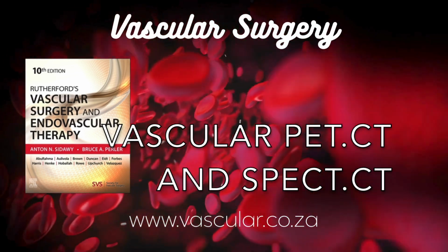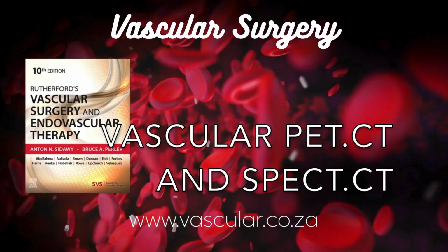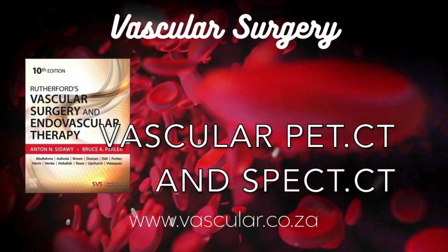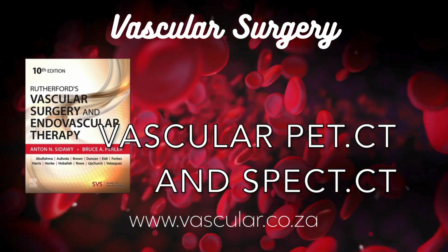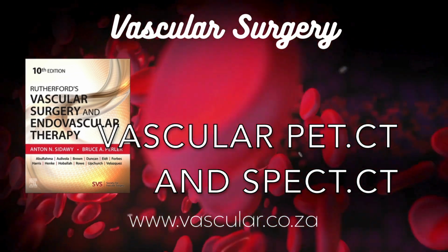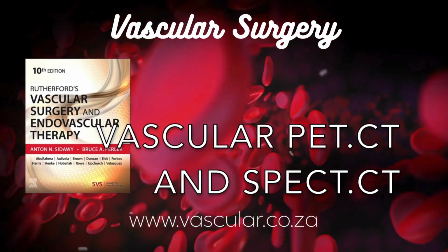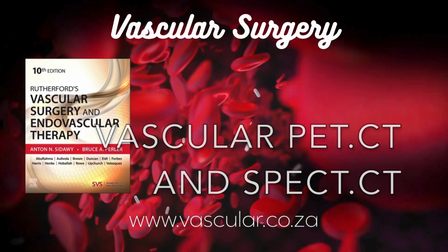Is there evidence linking this uptake to actual clinical events like stroke? Yes, definitely. A key early study by Rudd and colleagues looked at patients who'd had a TIA, a mini stroke, or a recent stroke caused by carotid artery disease. They found significantly higher FDG uptake in the carotid plaque on the side that caused the symptoms compared to the plaque on the other side. And importantly, when they examined the plaques surgically removed from these patients, the areas with the highest FDG uptake on the scan corresponded directly to areas packed with macrophages, those inflammatory cells. Wow, a direct correlation between the scan signal and the cellular inflammation.